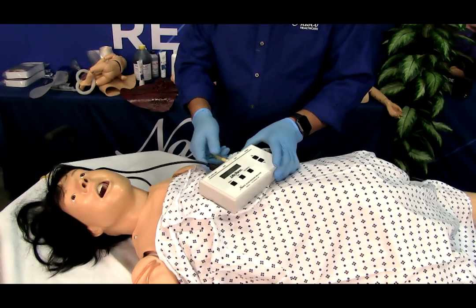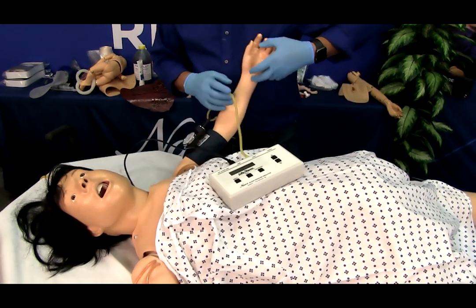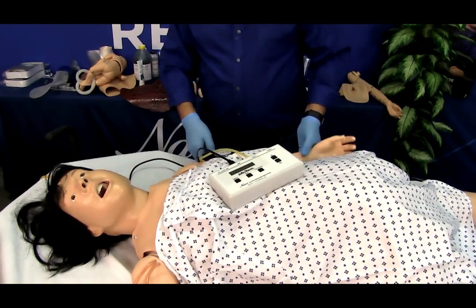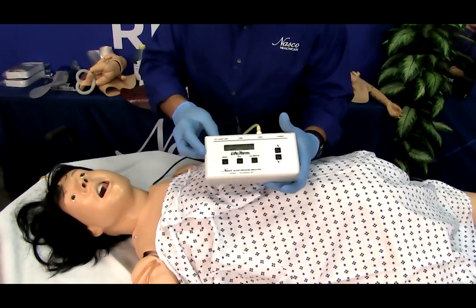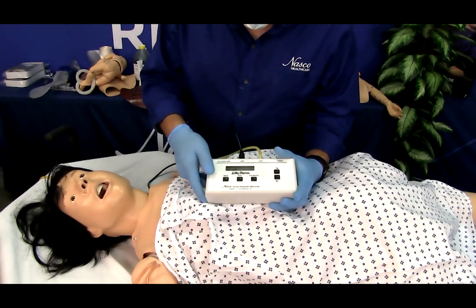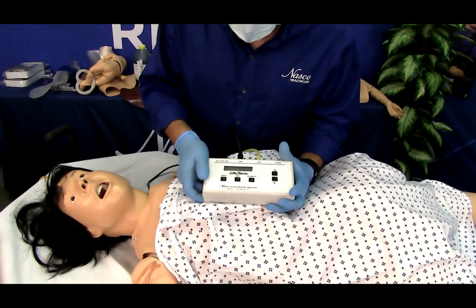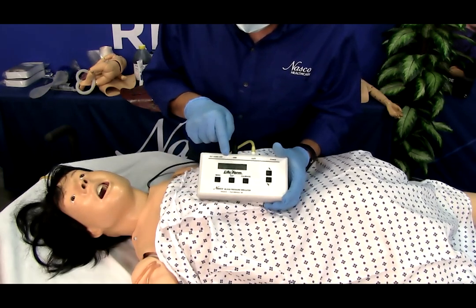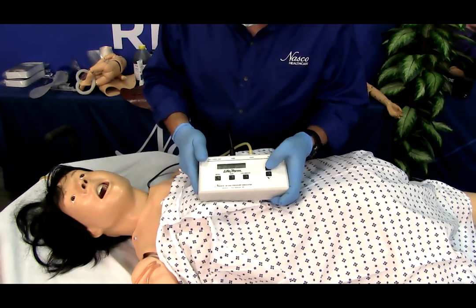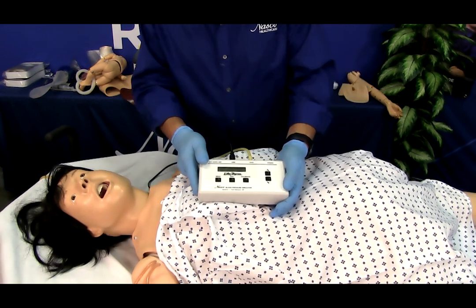To operate the electronic control unit function for the blood pressure arm, you will see that under the display window there are 3 buttons titled Menu, Gap, and Calibrate. To set the systolic and diastolic pressure, press the menu key once. The Set Systolic Pressure menu will display in the electronic control unit window. Use the up or down arrow keys located to the right of the menu button to adjust the systolic pressure.